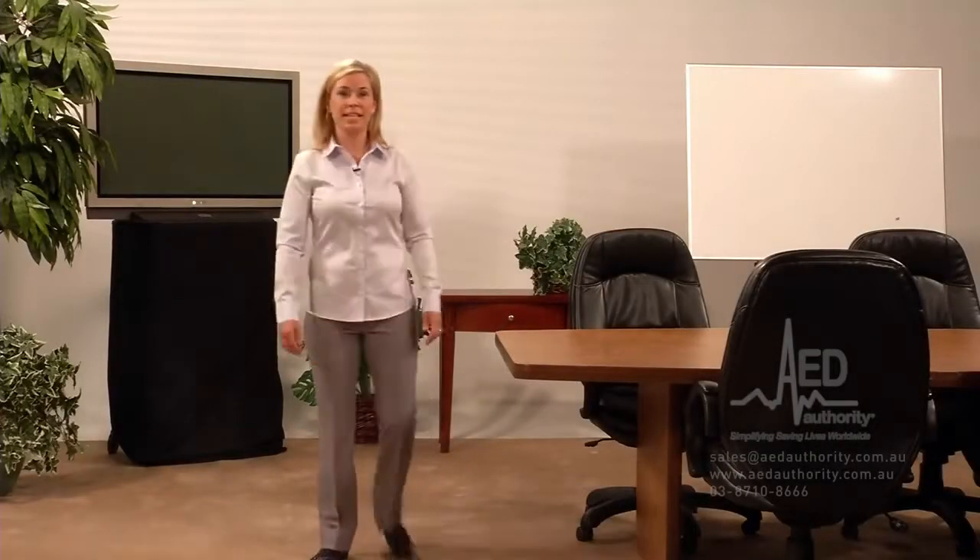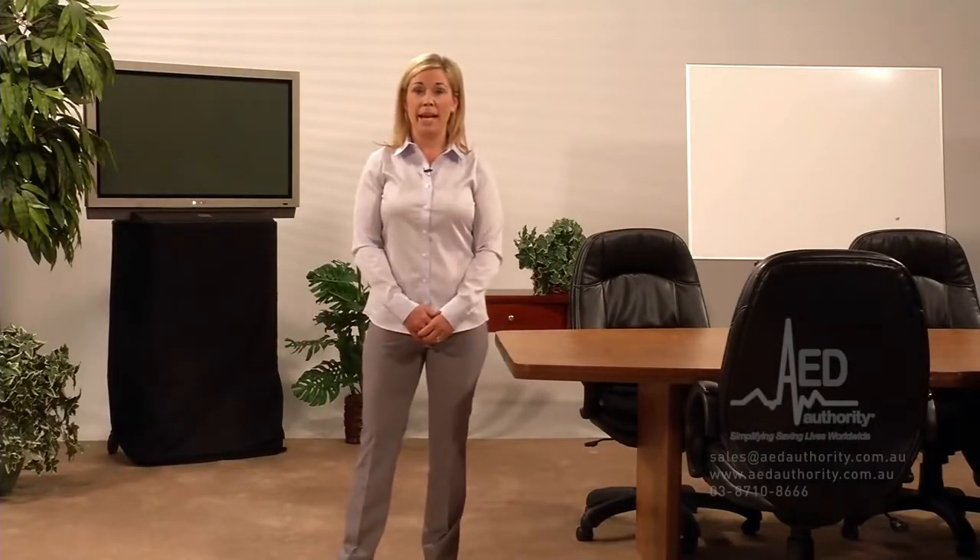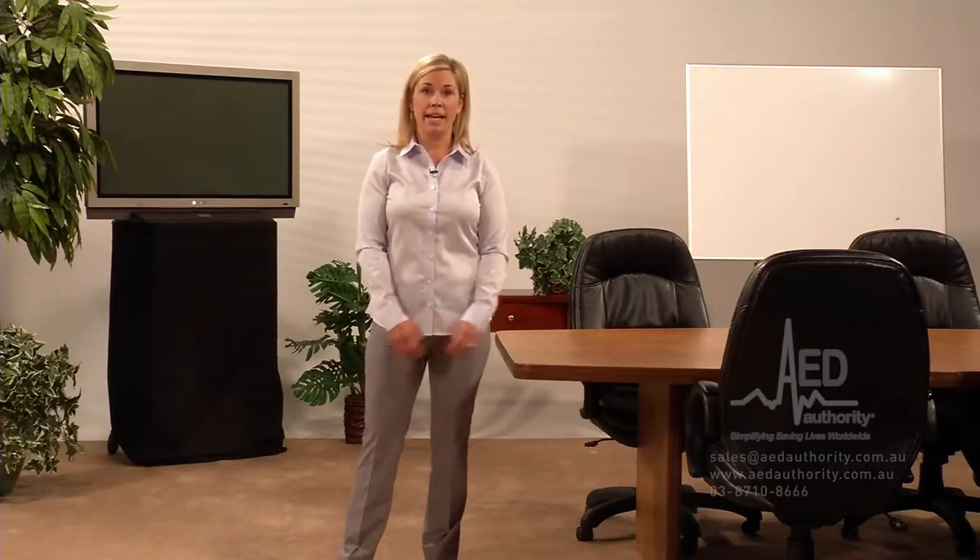Sudden cardiac arrest is a leading cause of death. It can happen anywhere, to anyone, at any time. I'm here to demonstrate how to use the LifePak CR Plus Automated External Defibrillator, or AED, in case you need to help someone in cardiac arrest.